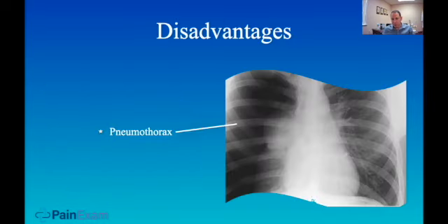Okay, in case you forgot how to read x-rays, this is a pneumothorax. Notice the absence of lung markings out to the side.